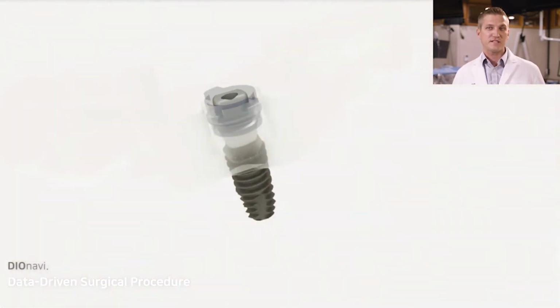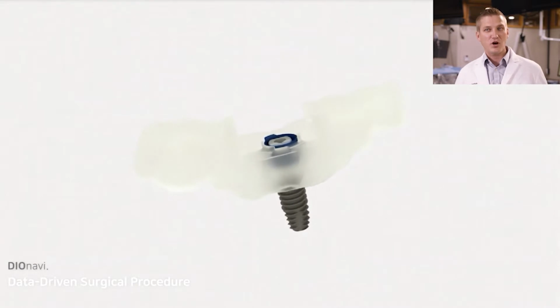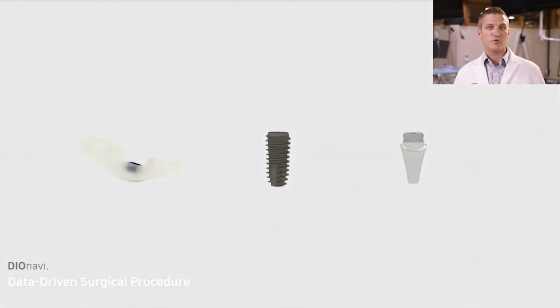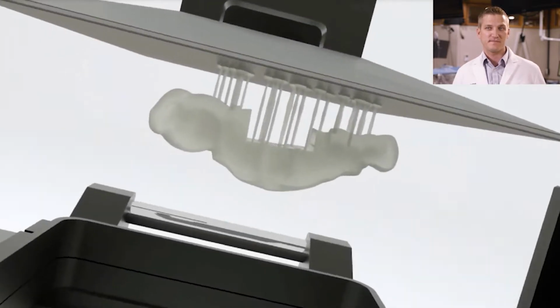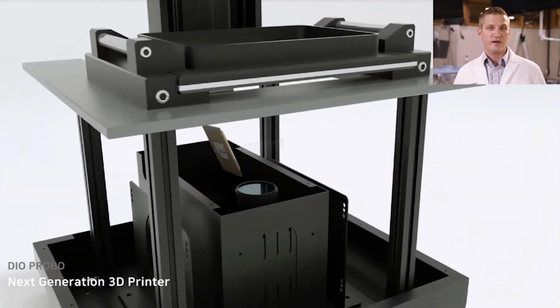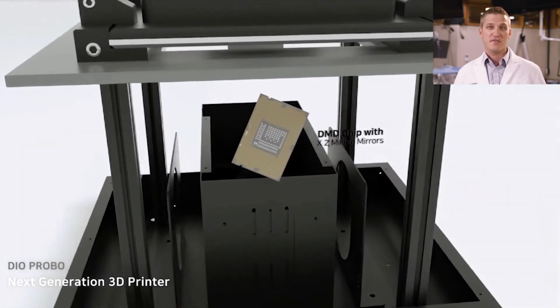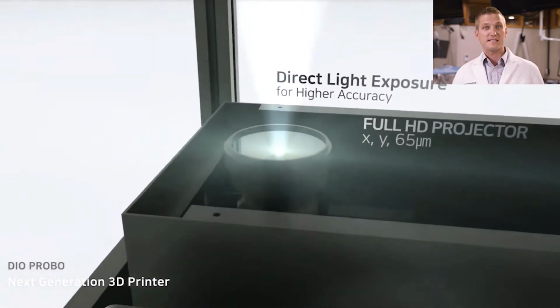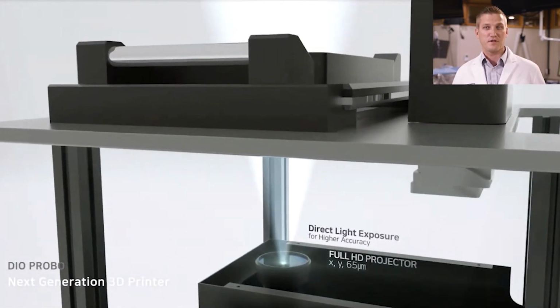Here you're seeing the use of a special abutment called an anatomical abutment. That's going to be key in some of the workflows of the DIOnavi system. So here's the process, the implant coming right off the 3D printer. This 3D printer is specifically designed from DIOnavi to seamlessly work within their workflow.